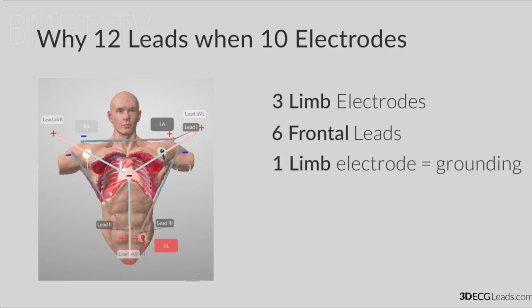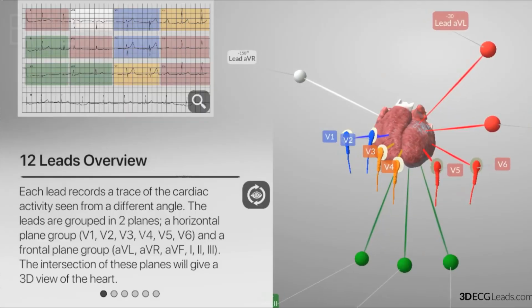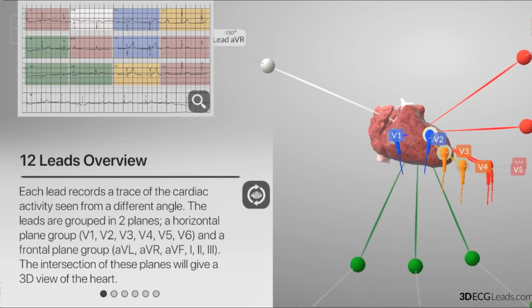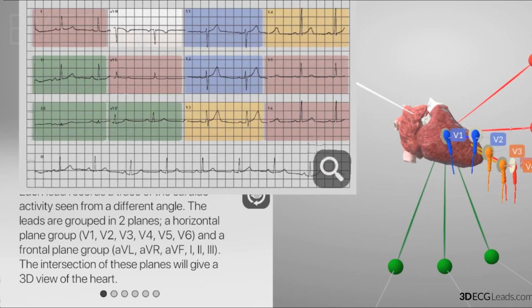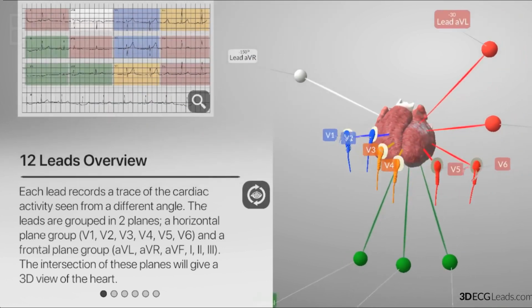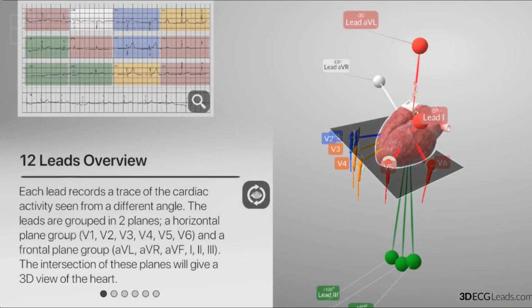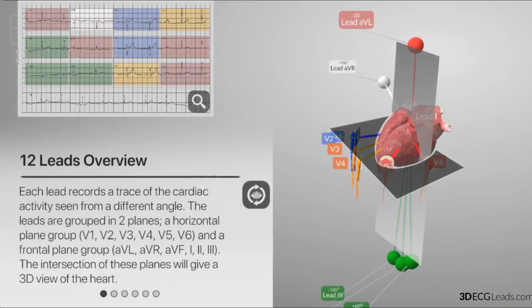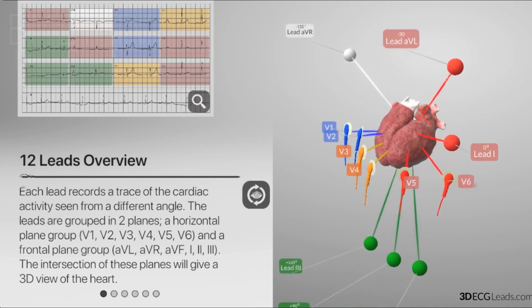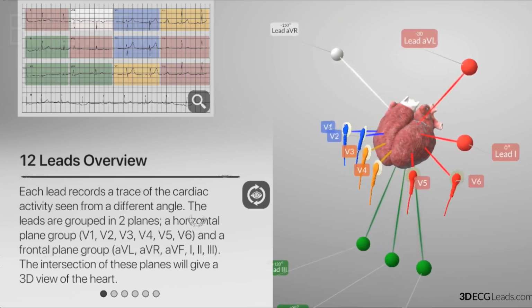In the frontal plane leads 1, 2, 3, AVR, AVL, AVF, the vectorial components of the frontal plane in 1, 2, and 3 are mathematically described as the second lead being a combination of the first and third lead. Augmented leads, AVR, AVL, and AVF can also be derived from leads 1, 2, and 3. Therefore, if 2 among leads 1, 2, and 3 can be obtained, we can reconstruct 6 frontal plane ECGs.